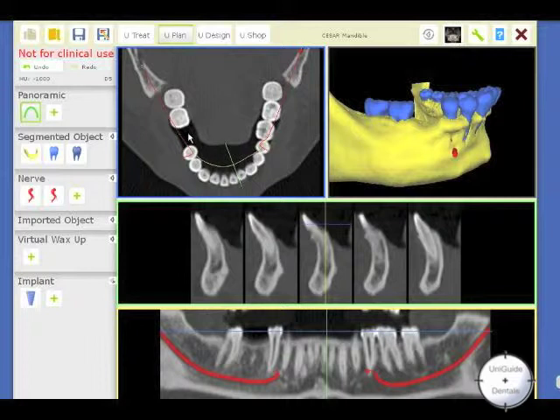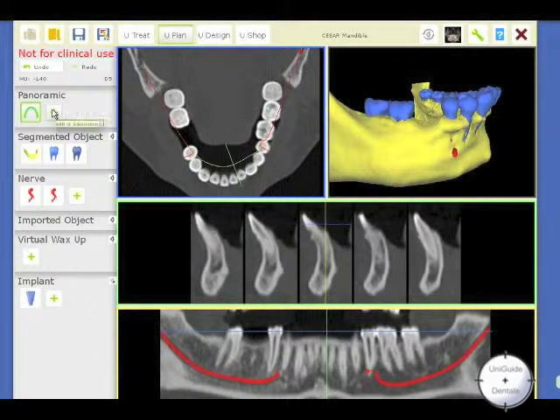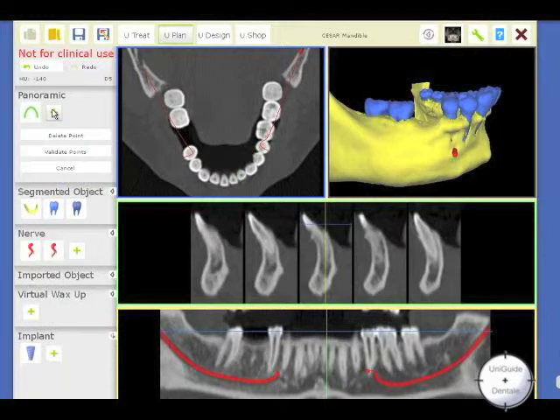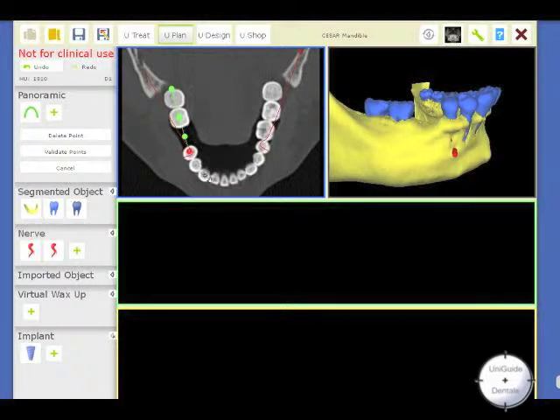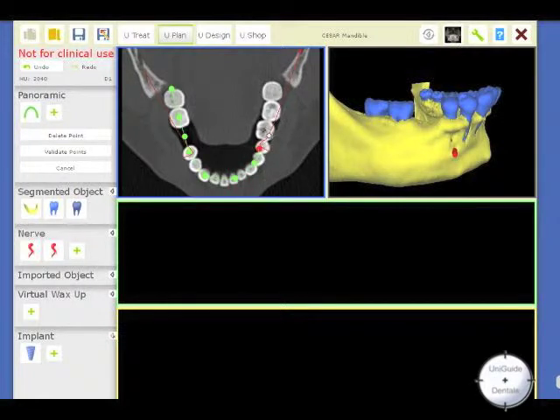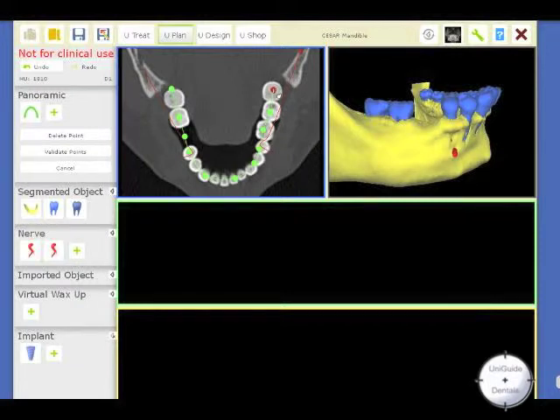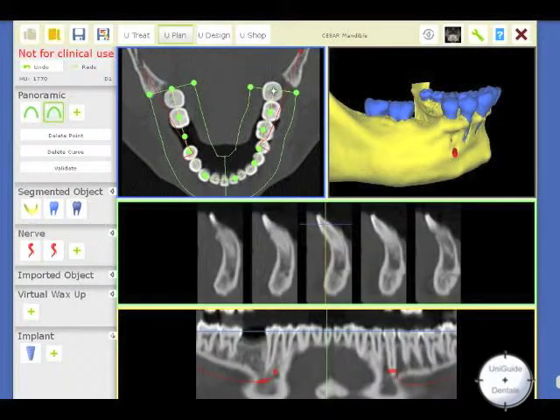For this, you have to follow the step-by-step procedure. You go to Panoramic and in the center of each tooth, you are going to put a point. This will draw a new curve — a new panoramic curve — which is different from the curve that you use when you want to build up a nerve.